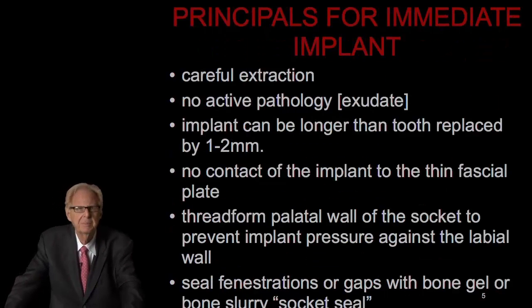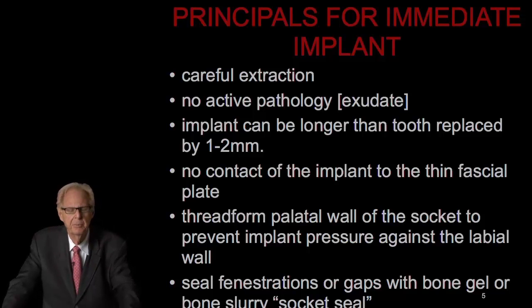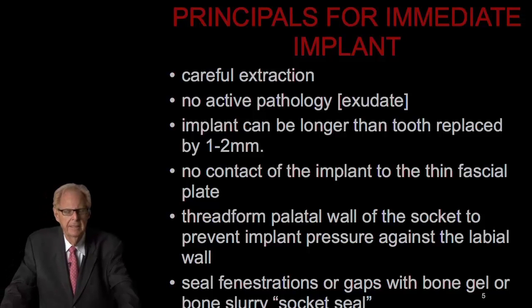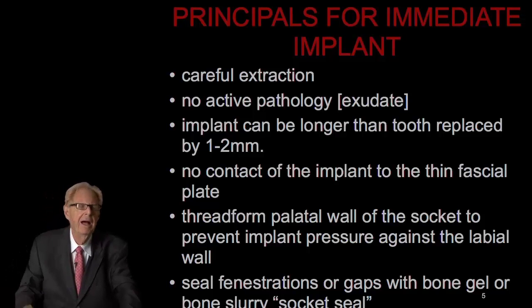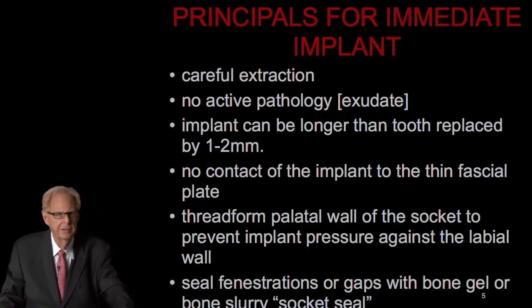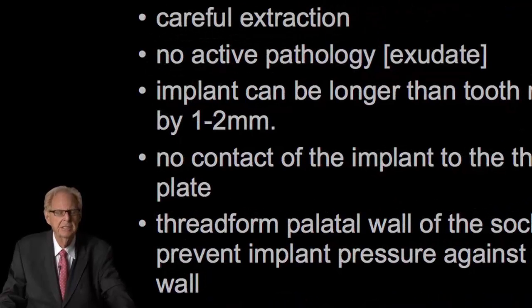So the principles of immediate implant, which we must follow in order to get repeated predictable results. And this is something that I've been doing for many years, and when we follow these principles, we do have long-term predictability. So we're going to discuss some different methods of extraction.